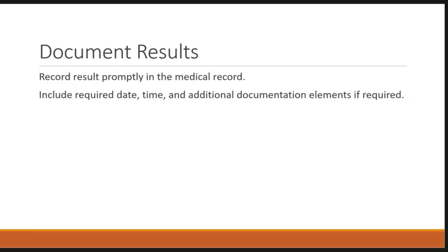Test results should be documented promptly and accurately in the patient's electronic medical record or other approved documentation system. You cannot rely on your memory. You can't walk to the nurse's station and input the results from a piece of paper. You need to hold the meter in your hand, put the results into the medical record, and then verify, because I have at times had a clerical error where I added maybe an extra one or deleted a number accidentally. So put the result in, verify the result prior to releasing.